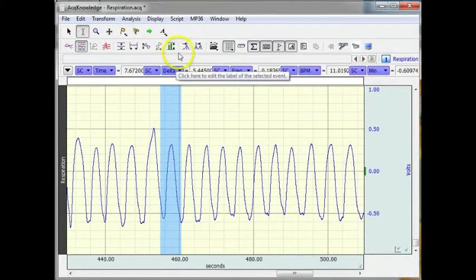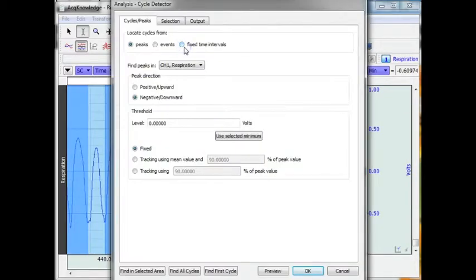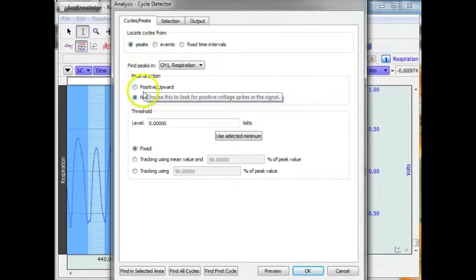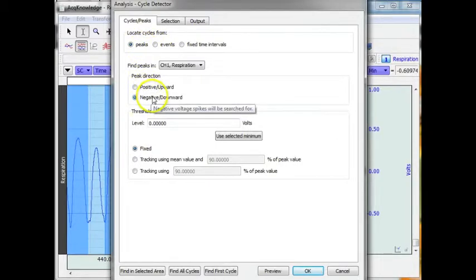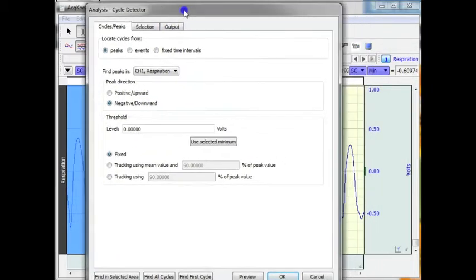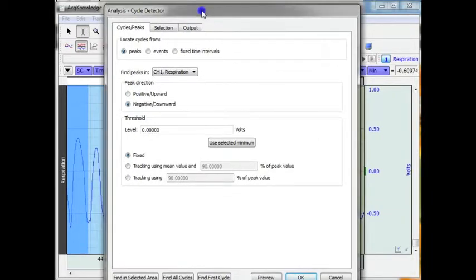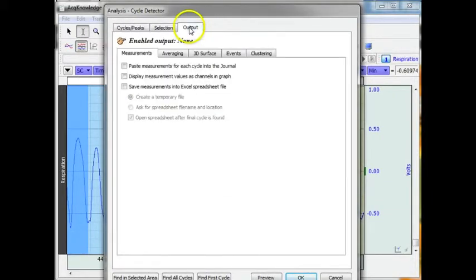So to start with, I have highlighted one representative cycle. Select peak. I am going to say it is a negative going peak. And I have got my threshold set to zero because that is pretty much in the center of my signal.